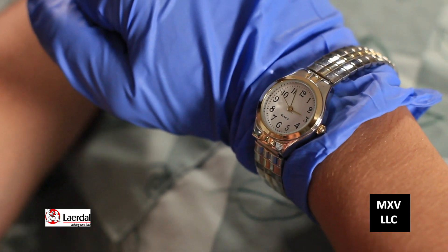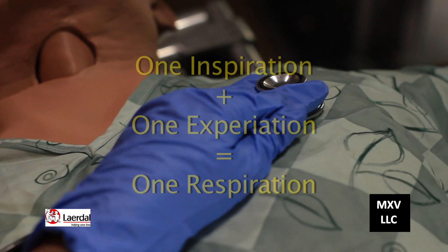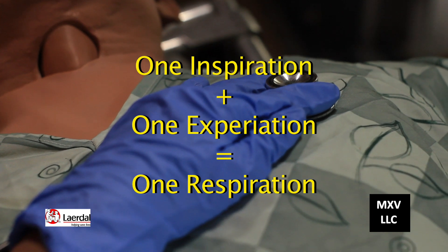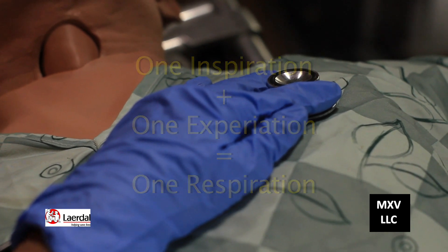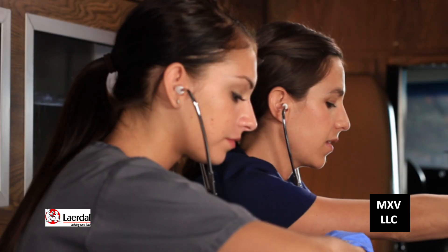Today's essential skill will be checking your respiratory rate. I'm going to show you how to do that. We need a watch or a clock with a second hand. Go ahead and put your earbuds on, make sure they're clean, and we have our gloves on already. Now we're going to take the stethoscope, place it over the apex of the lung, and listen for the respirations, which is one inspiration and one expiration. Now I'm going to use the second hand of our watch and listen for 30 seconds.